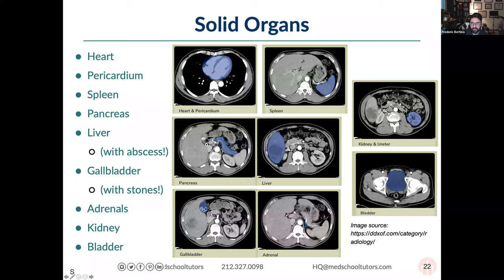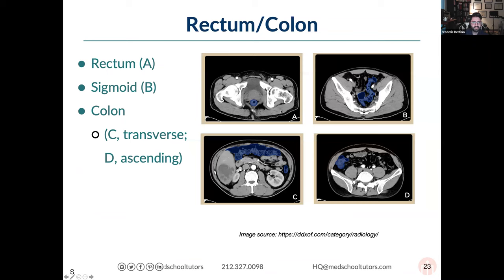The kidneys are two paired retroperitoneal structures surrounded by fat. The right kidney sits a bit lower than the left because the liver pushes it down. The gallbladder sits in the gallbladder fossa, anterior and underneath the liver on the right — this one has calcified gallstones visible inside. The adrenal glands look like triangular wizard hats sitting on top and anterior to the kidneys; thickening suggests hyperplasia, while masses or nodules could represent adenomas or pheochromocytomas. The urinary bladder is low in the pelvis between the pelvic bones.